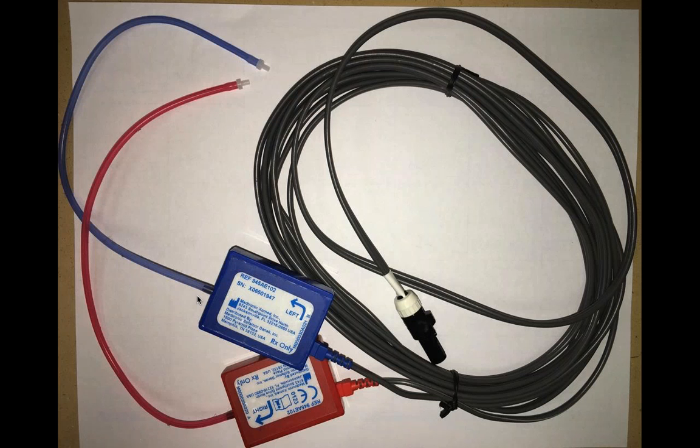This is what the hardware actually looks like. This is the most common set that we use for the intraoperative usage of BAERs. We have the box right over here that plugs into the computer, and then these 2 transducer boxes, one for the left, one for the right, color-coded for left and right to keep them straight.